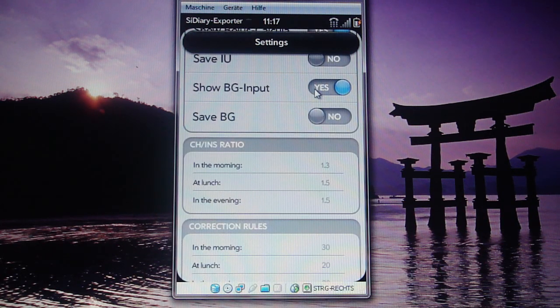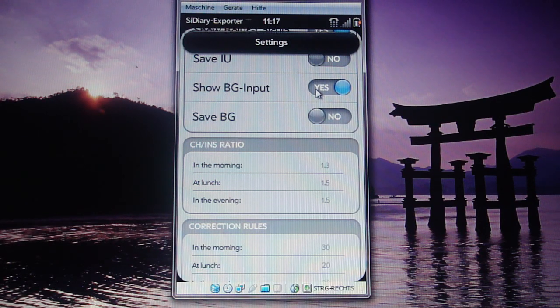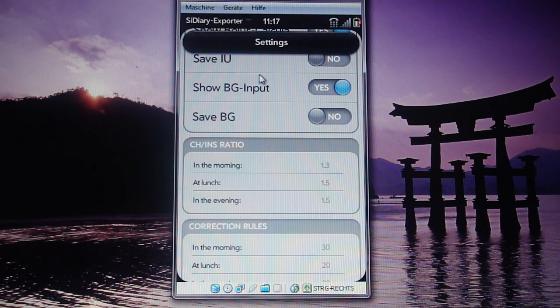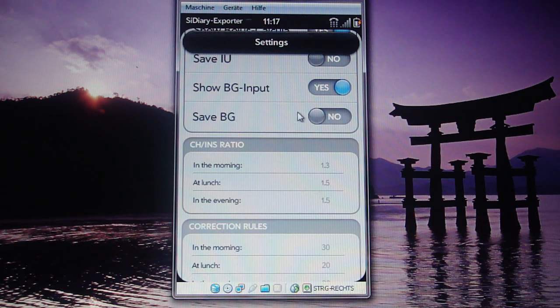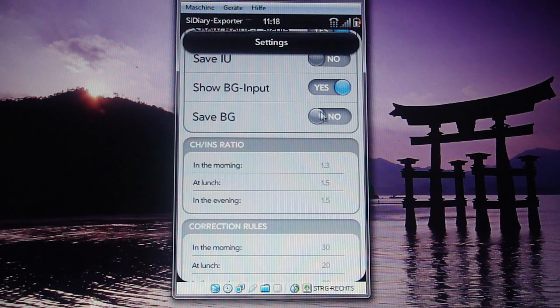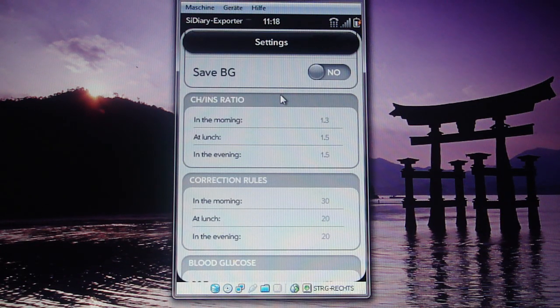Next is whether you want to show an input screen for your blood glucose value. This makes sense if you want to have the insulin proposal, because the blood glucose value is needed for that calculation too. Similarly, for blood sugars, you can choose whether to save it into your profile or not. I also do not save it because I read out my blood measuring device.